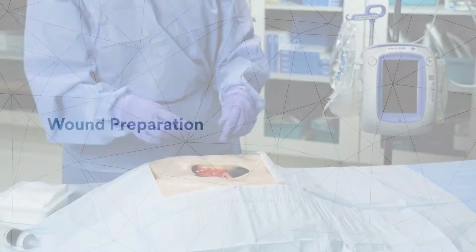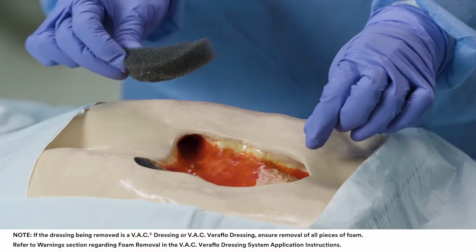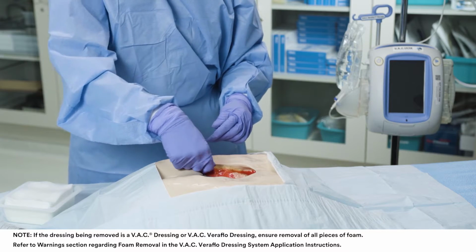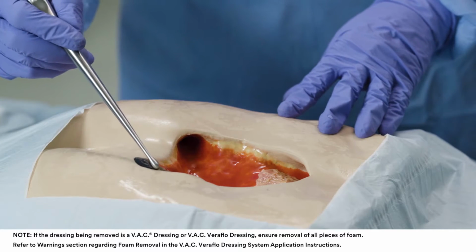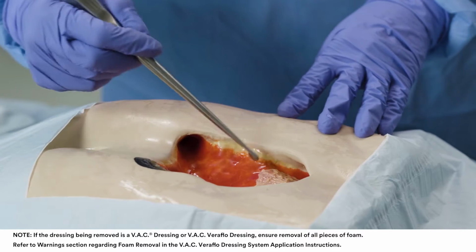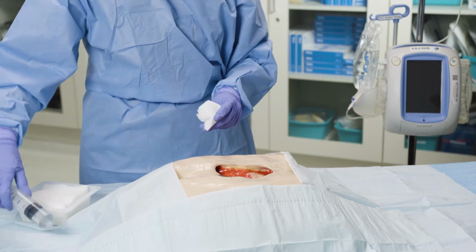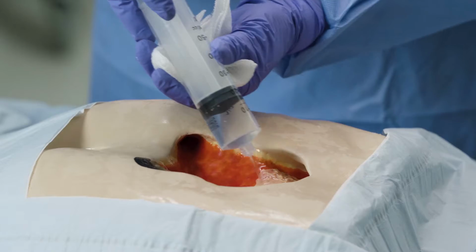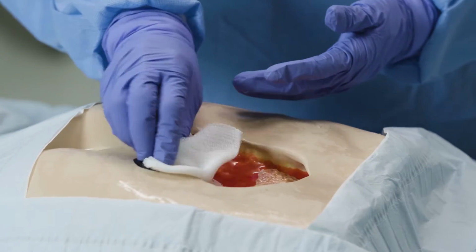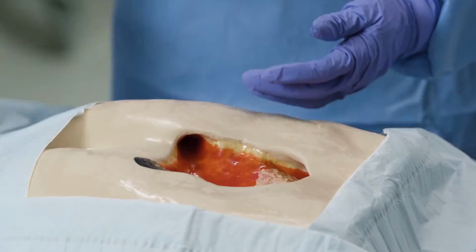Before applying a new dressing, remove and discard the previous dressing per institution protocol. Thoroughly inspect the wound to ensure all pieces of dressing components have been removed. Ensure debridement of all necrotic, non-viable tissue, including bone, eschar, or hardened slough, as prescribed by the physician. Perform a thorough wound and peri-wound area cleaning per physician order or institution protocol prior to each dressing application. Protect fragile or friable peri-wound skin with medical-grade transparent film, skin protectant, or hydrocolloid.